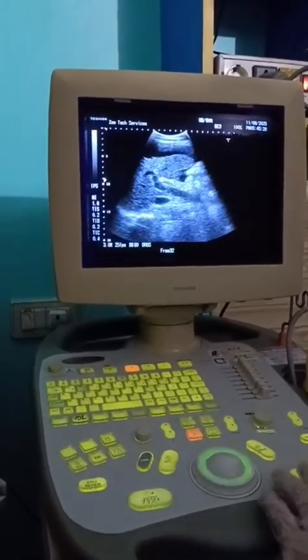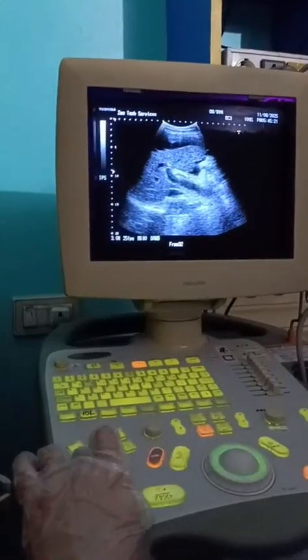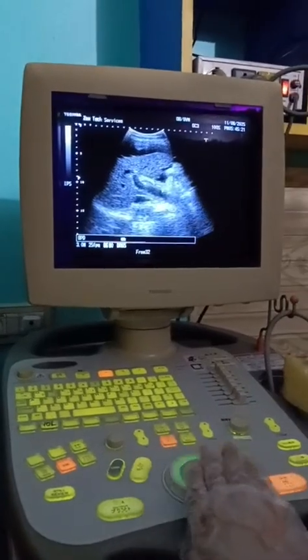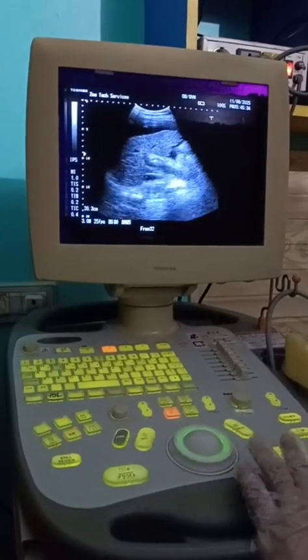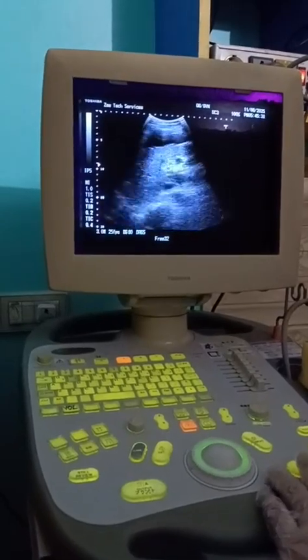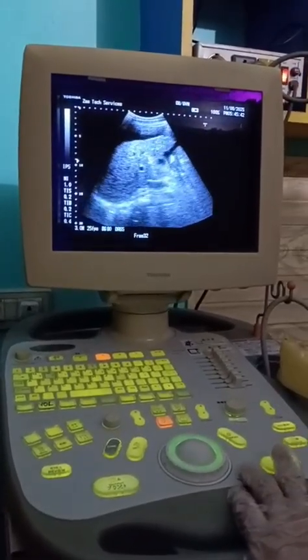Periportal fibrosis, here is the wall of the portal vein. This is the portal vein. The wall is quite thicker and showing enhanced echopattern. This is called periportal fibrosis, which is also visualized in the liver as well by its increased echopattern.